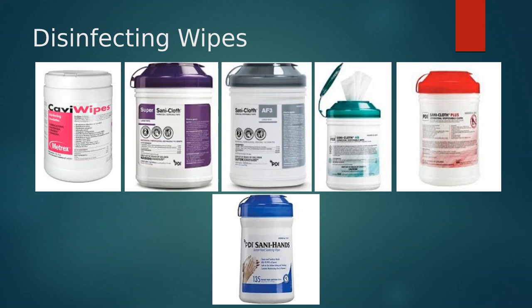We are using a lot of the purple, gray, and green, like we said. We do have purple at the school. Purple is what we should be using for really any kind of surface. The problem with purple wipes is that it can discolor certain plastics. So if we use the purple wipes, we want to make sure that we're not using them to clean a lot of the cord on the transducer, and that we're not using them to clean the machine.